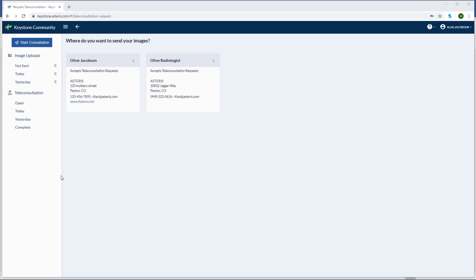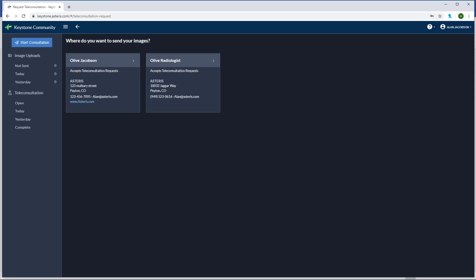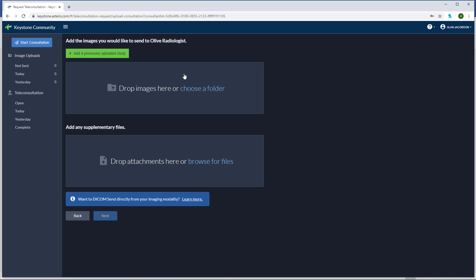Once you're in the community portal, first thing I like to do is actually change to dark mode. Up at the top right you can easily switch between dark and light mode. Now you can see I have several available consultants. Each consultant will have their own unique URL. It turns out that I have some radiographs I'd like to send to all of radiology services. Click on your desired specialist to start the process.